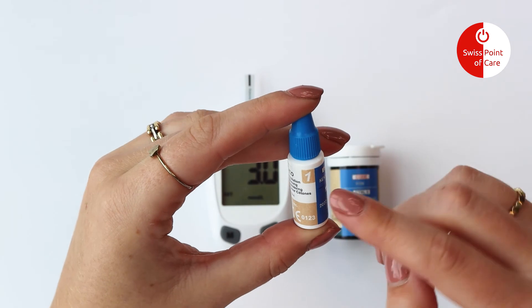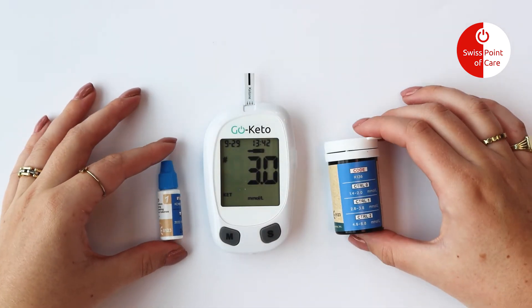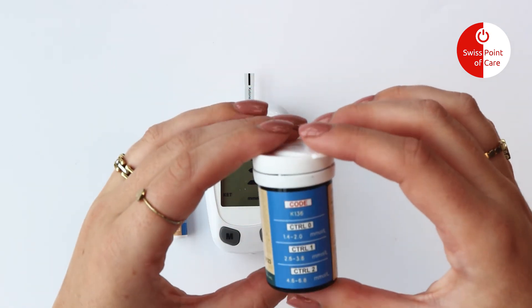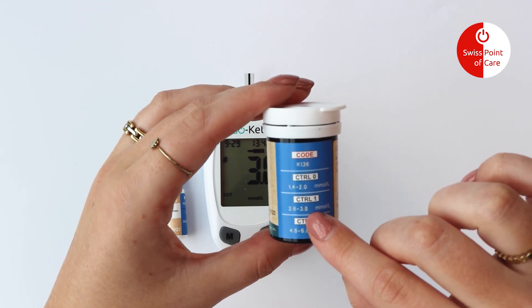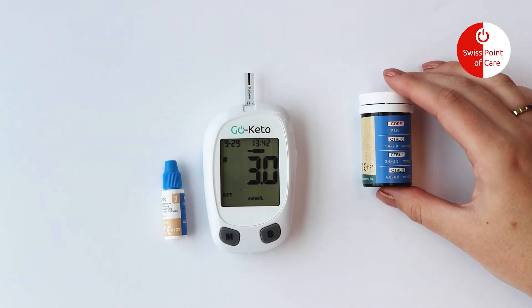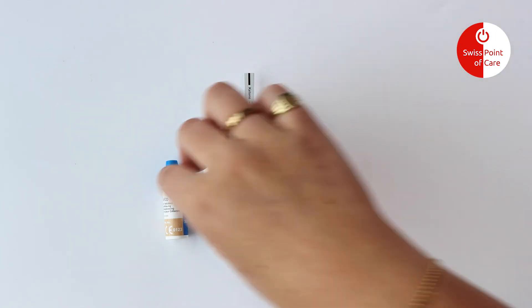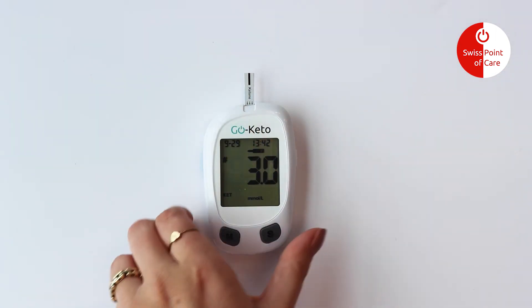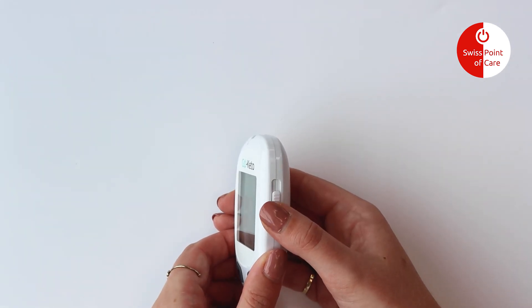Compare the result to the control range printed on the test strip vial or on the foil pouch. This means the system is working properly and that you are performing the test correctly. Slide the strip ejector forward to discard the used test strip.